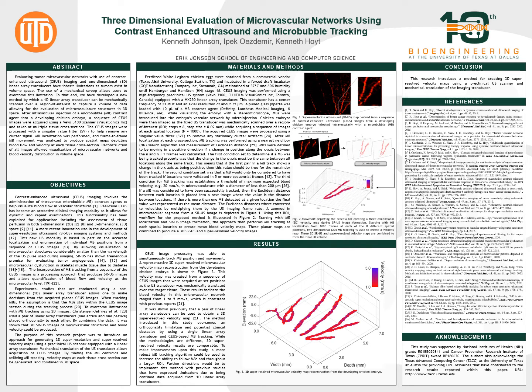A process was defined by first injecting microbubbles intravascularly as a contrast agent into a developing chicken embryo. A transducer was then scanned over a region of interest to capture a volume of data with 1,000 sequential images at each of the 8 tissue cross-sections and a step size of 0.09 millimeters between them.